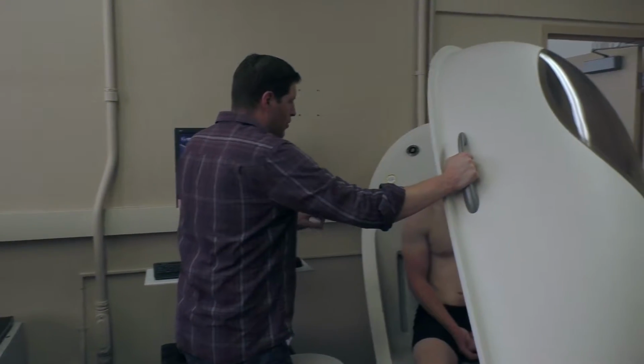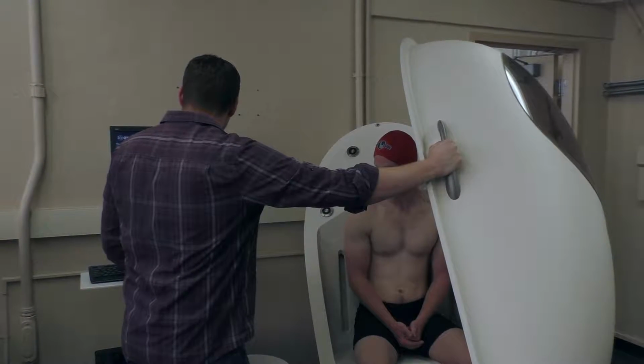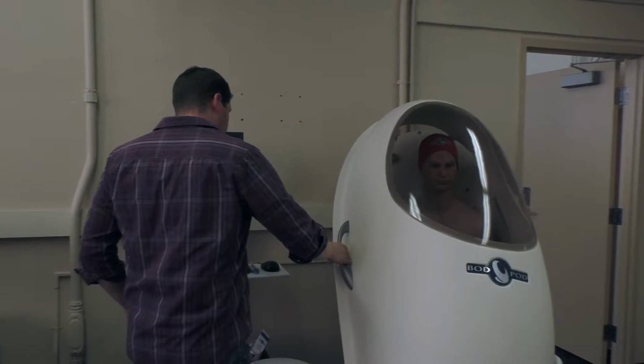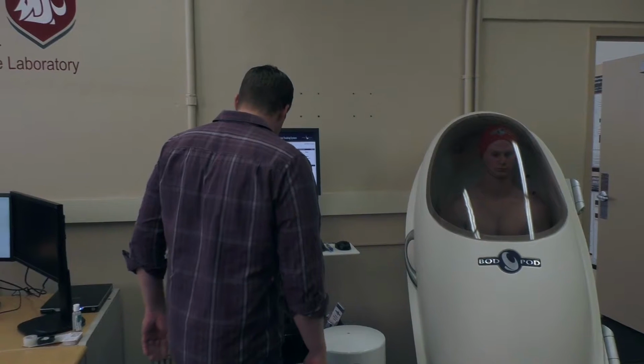We'll open up the bod pod, make sure they're okay. Tell them we're going to do exactly the same thing and remind them to hold still. Here we go. And again, we're going to shut the door very slowly just to make sure the seal isn't damaged.